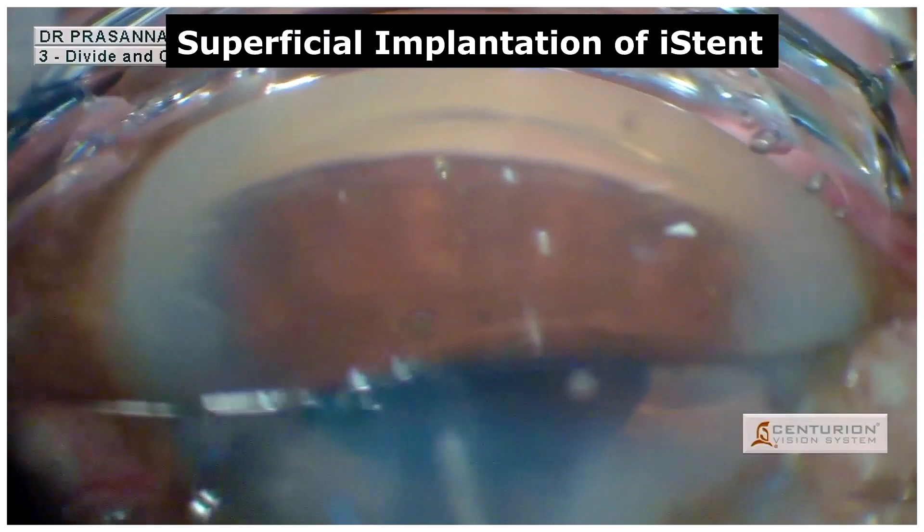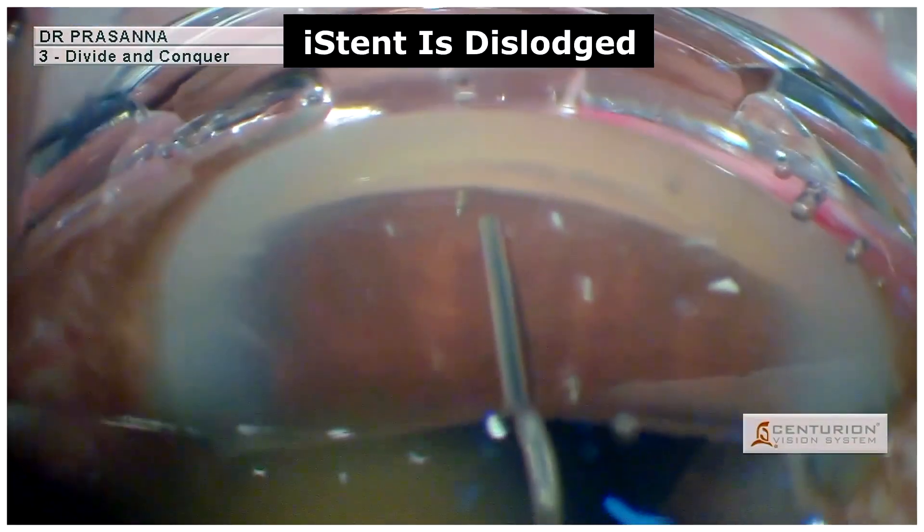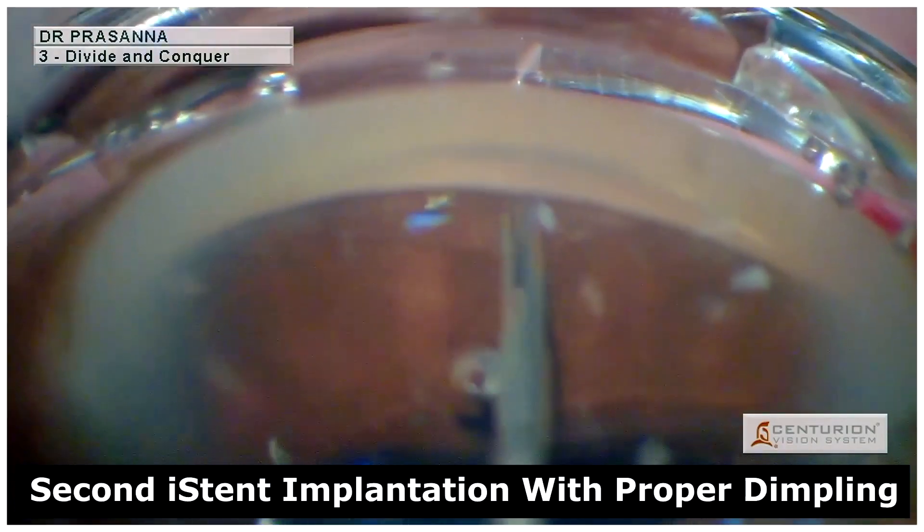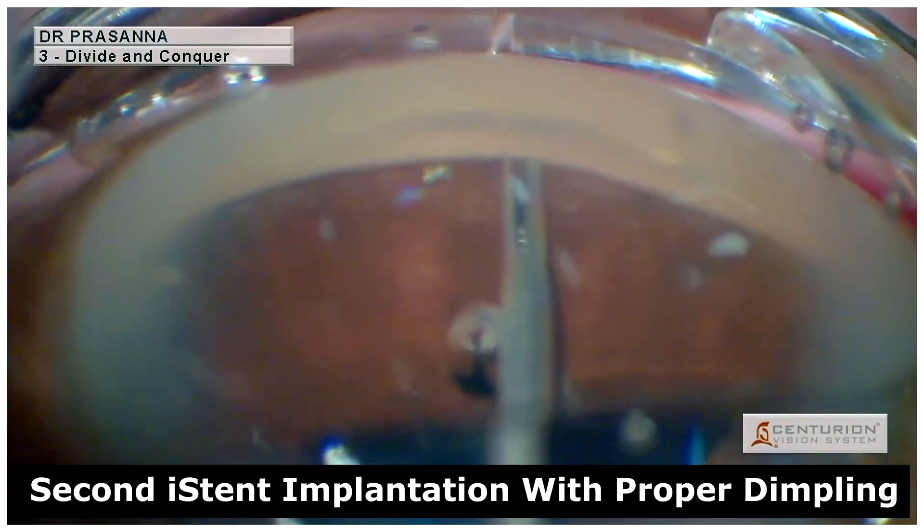And hence, the iStent was dislodged. Continuing the procedure, a second iStent was implanted with the proper dimpling technique.